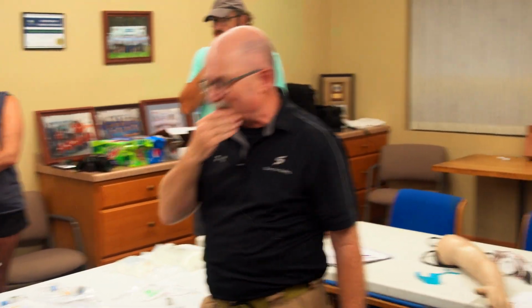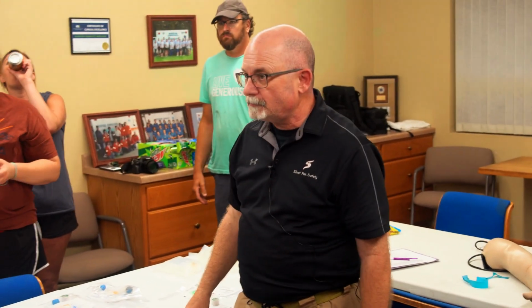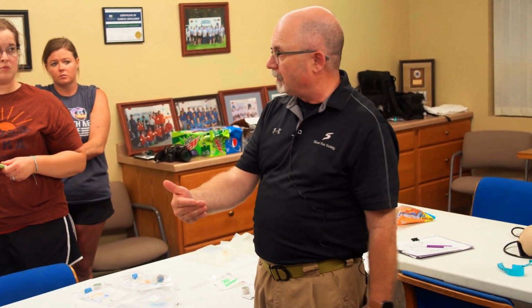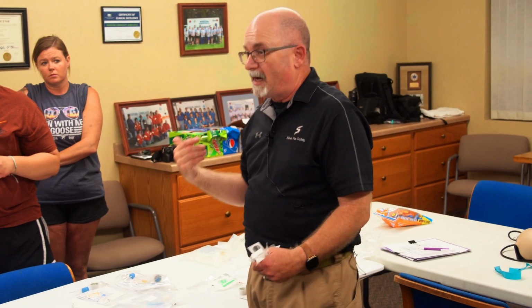So make sure that you're only documenting how much was given when they take responsibility of the patient. So if you put 100 in, that's great, just put 100, that's fine. You could put down that we hung a liter bag but only administered whatever amount, however you want to do that. I don't even bother with that part.